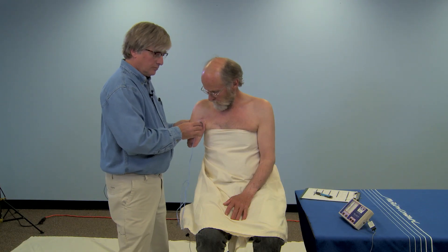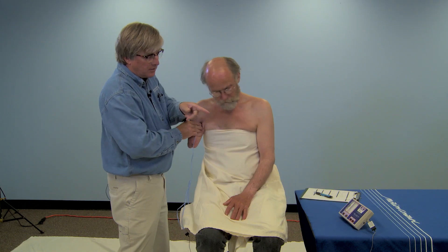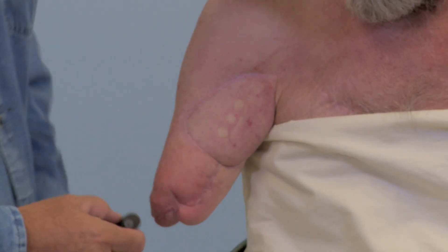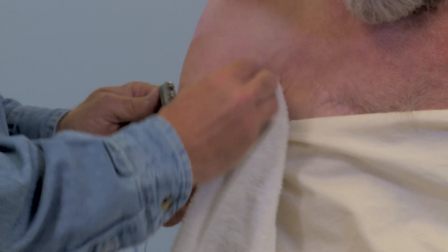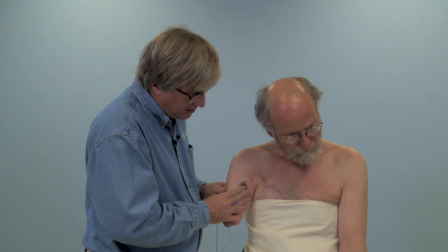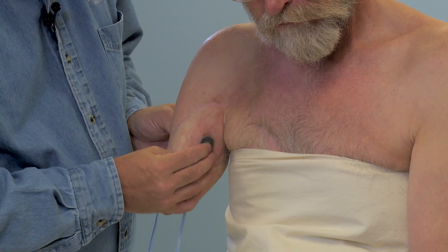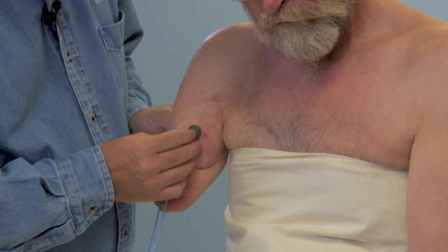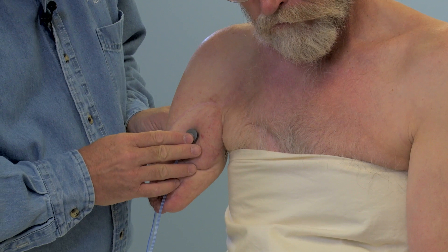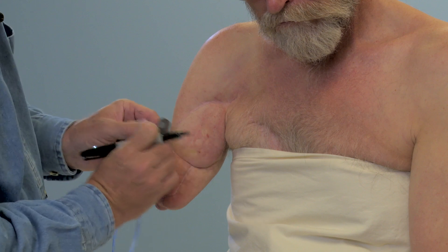Starting with the biceps, place the A channel electrode in line with the largest portion of the muscle. Have the patient flex and watch the EMG signal on the Myolab together. Encourage the patient to maximize the signal. Be aware that dry skin may cause a poor signal — electrode gel or tap water can be used to moisten the area of the electrode site. Move the electrode laterally and note the site with the highest signal and the total area in which a strong signal is found. Now move the electrode proximal and distal, searching again for the highest signal. Mark this site and the entire area with a permanent marker or indelible pencil.